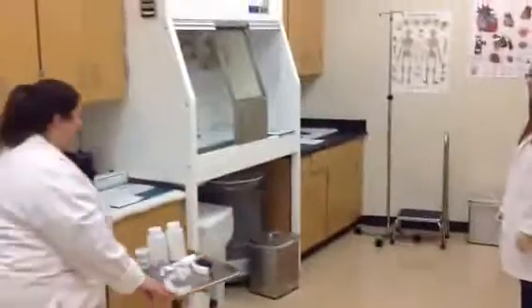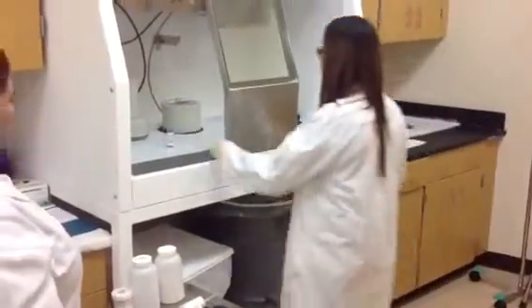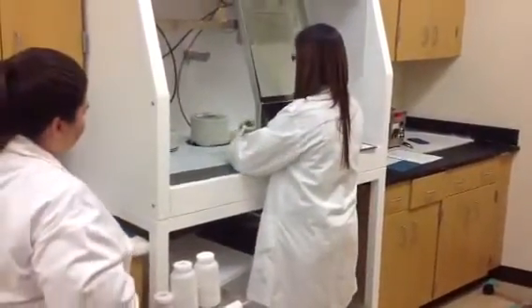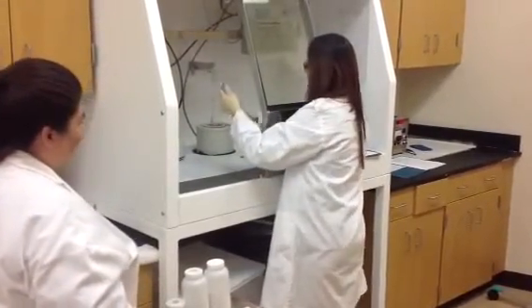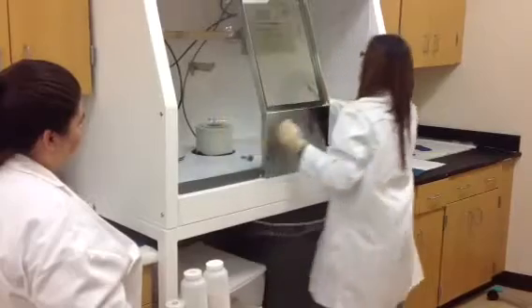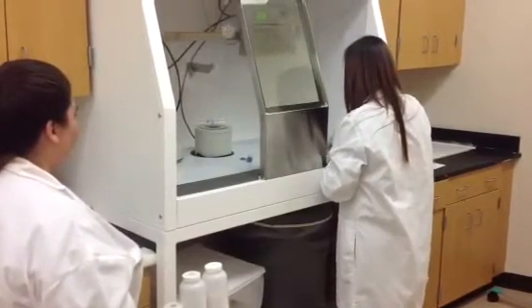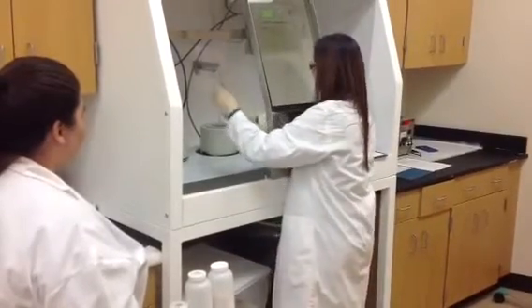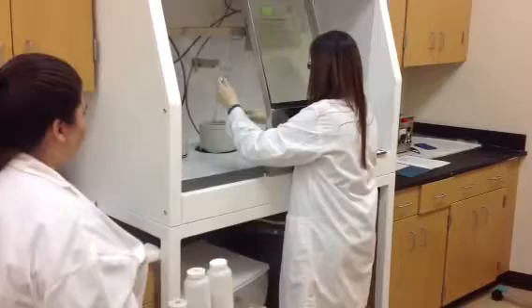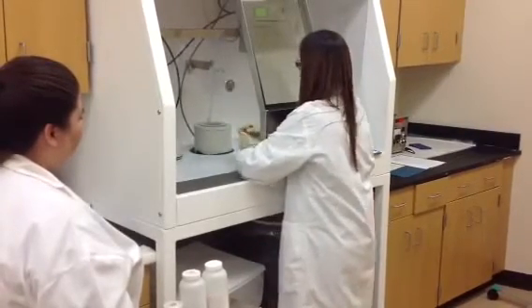Make sure the system is in the start position number 1. Set the timer to 9 minutes. Remove the face mask or mouthpiece from the tubing. Place the face mask over the patient's face and attach mask retainer or mouthpiece and nose clip. Have the patient breathe to get accustomed to the face mask. With the handle in the start position, connect the mask to the hose. Instruct patient to breathe briefly while becoming accustomed to the face mask and tubing. The front patient bag will move slightly as the patient exhales.